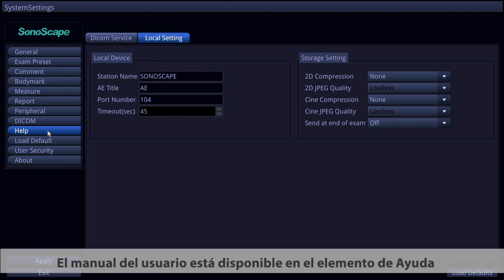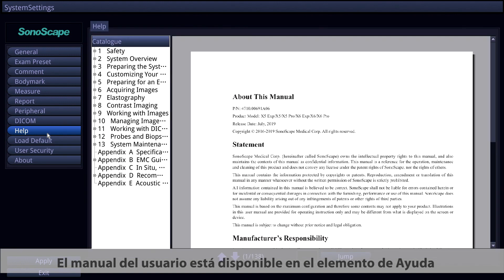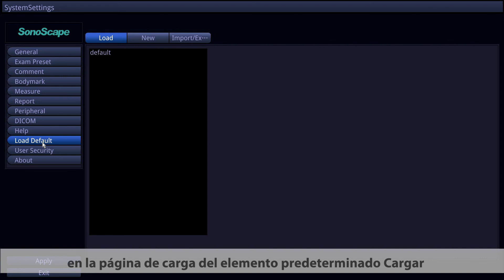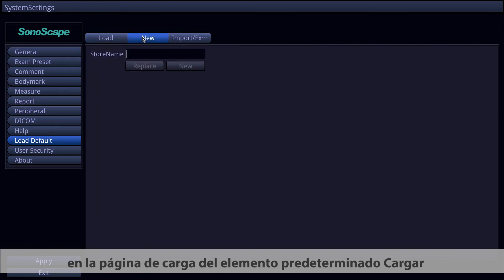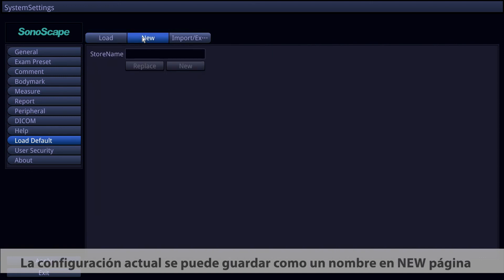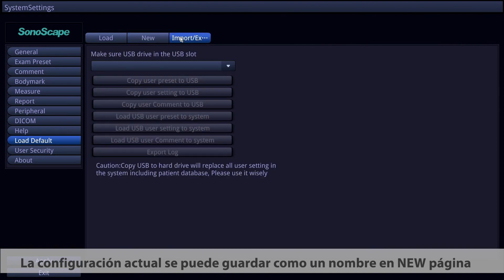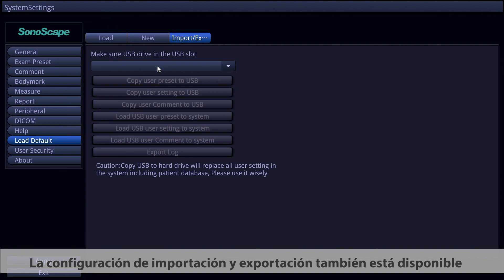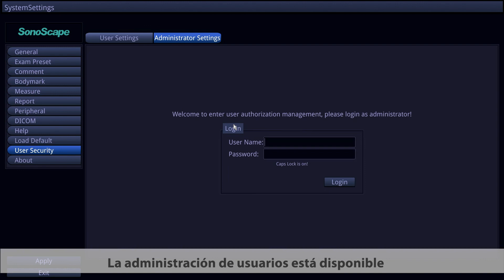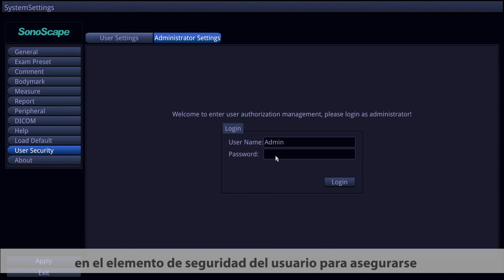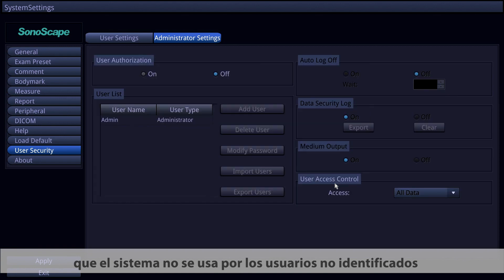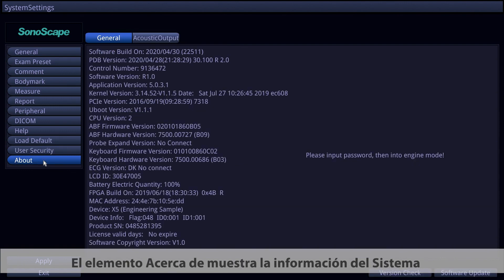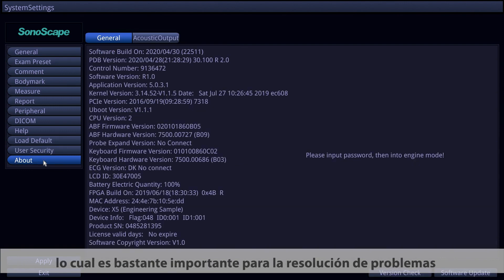The Help item contains the user manual, where you can load default settings on the Load Default page. Present settings can be saved with a given name on the New page, and importing and exporting settings are also available. User management is available in the User Security item to prevent unauthorized access. The About item shows system information, which is important for troubleshooting.